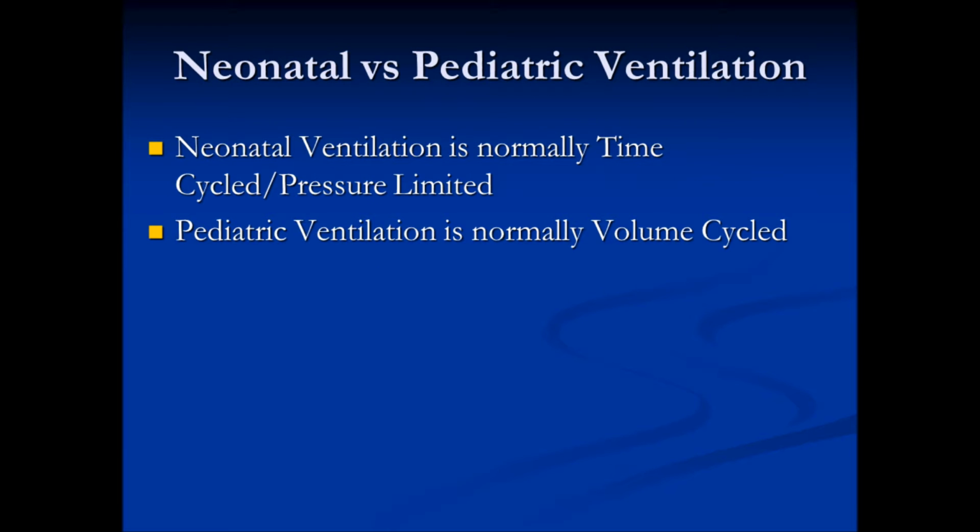Okay, there is a difference between how we ventilate neonates versus how we ventilate pediatric patients. With neonates, we will use time-cycled pressure limited ventilation. That's important. NBRC will ask you that in some format.